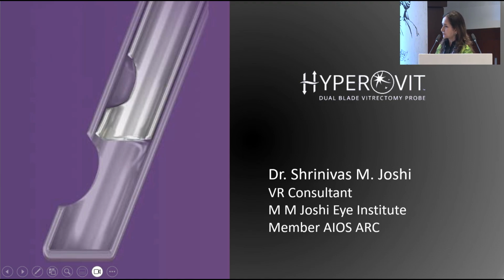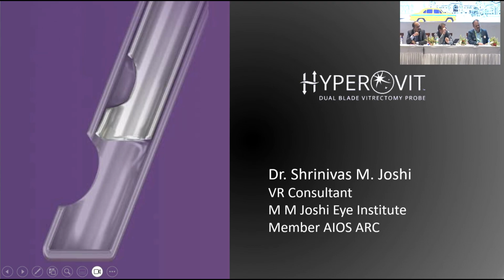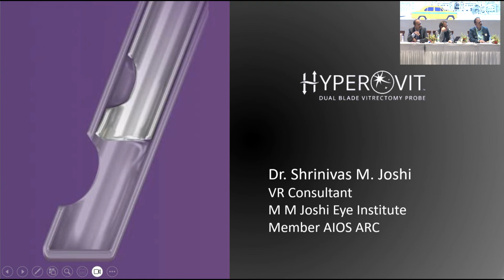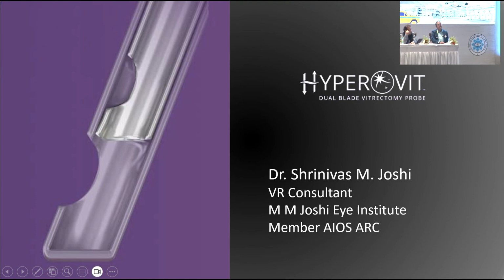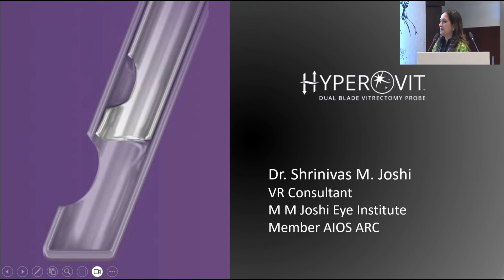If you pick up the membrane from the disc, and all the membranes are not cleared, and if you get a bleed on the disc, what are the measures? So the vital thing is what you said already. First clear everything else before you pick it up from the disc. Because there will be very little that you will be able to do. You can't cauterize on it. So other than increase IOP and reduce blood pressure, you can't do much.